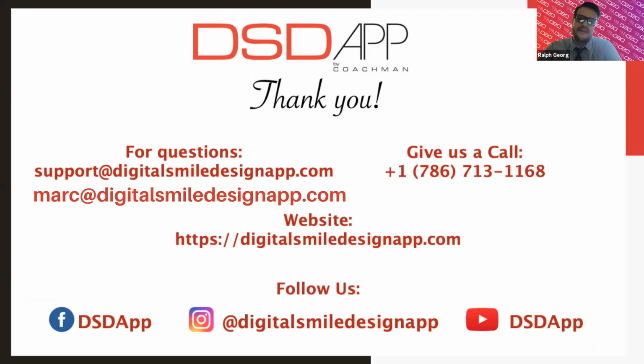That's a great point. DSDApp by Coachman is not just for you, the clinician. We have multiple thousands of cases where the doctors bring in their team members, they become empowered, they feel like they're a part of the team, they feel great about it, and they're doing the simple smile simulations. While you're with one patient, you have your front desk girl doing a simple smile simulation.